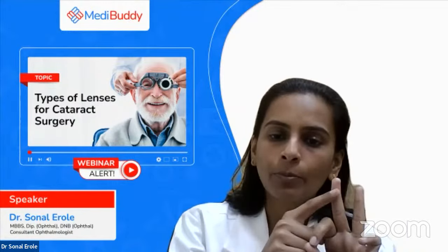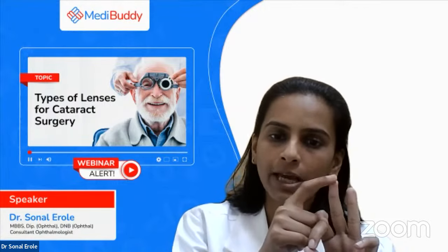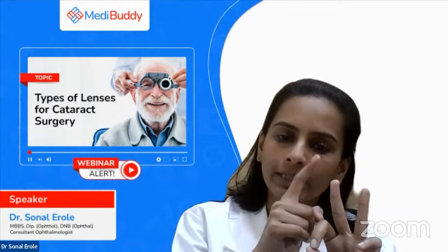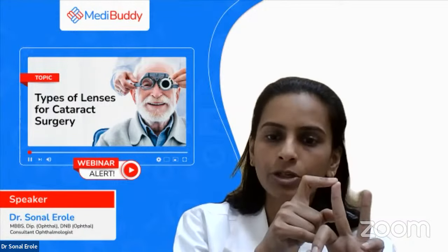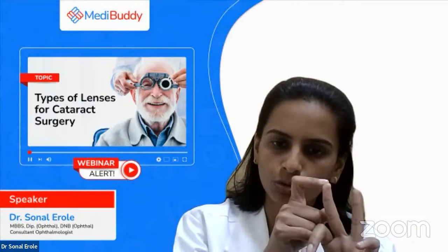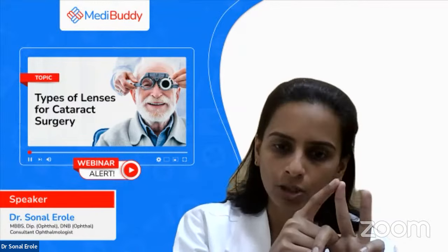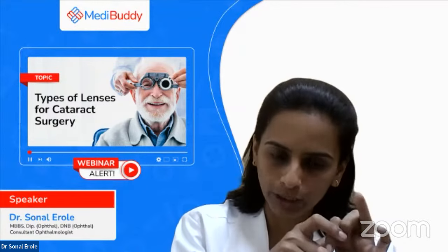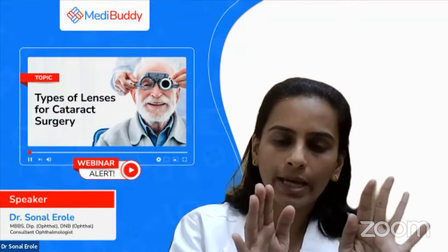If they opt for the multifocal toric or EDOF toric, then they will have this toric power in those lenses also. So they will have good distant vision and good near vision. They will not need to wear glasses for the distance and the near with these multifocal torics. So these are the types of lenses we have nowadays.